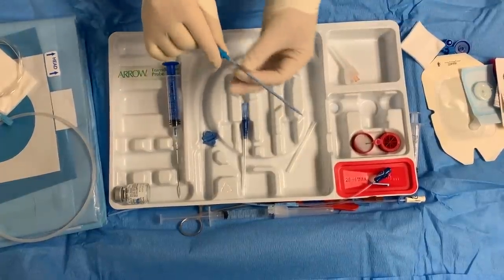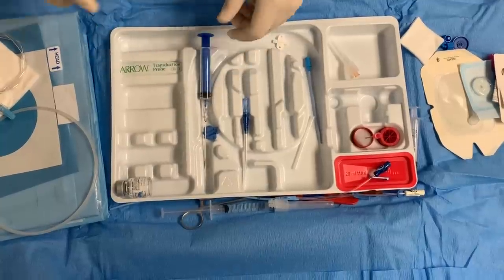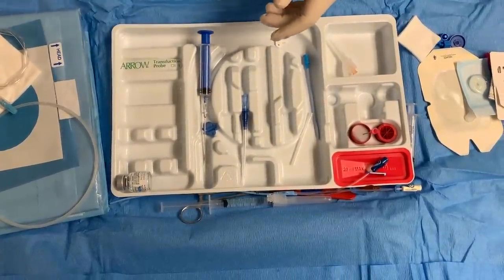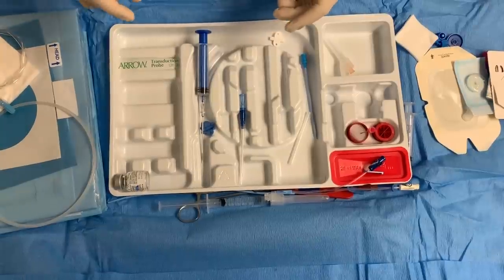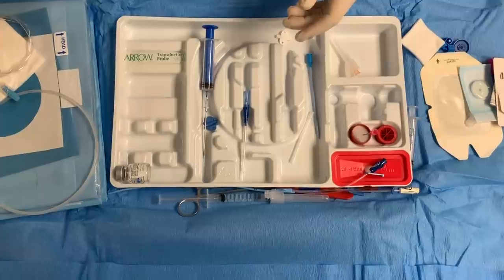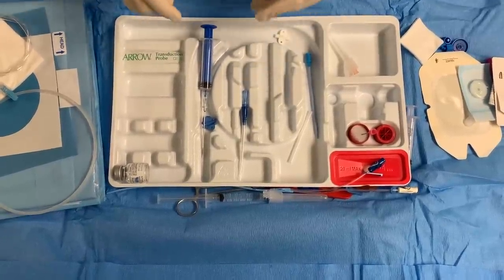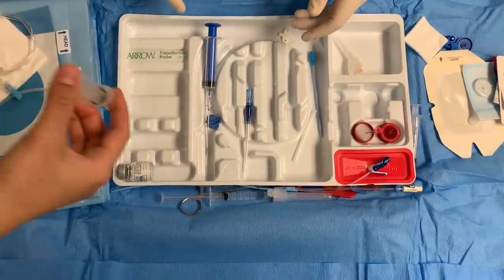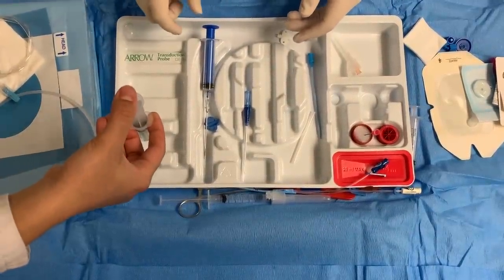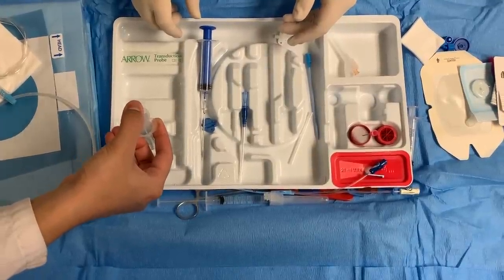This is going to be our dilator. What you want to do is squirt — open it up. Remember, you don't want to drop it in here; it's still not sterile. Open it up, take it out. Take out the little white tip. Then you're going to squirt it right in here — gently squirt it in there.